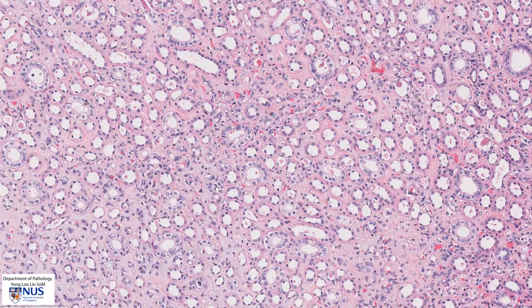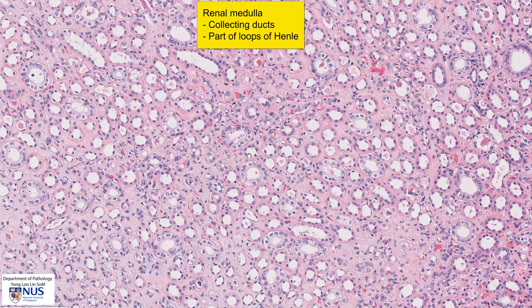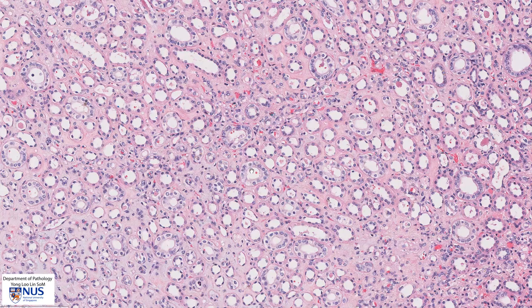This area looks quite different, and this is the renal medulla, which comprises collecting ducts and part of the loops of Henle. We do not see glomerular structures here.